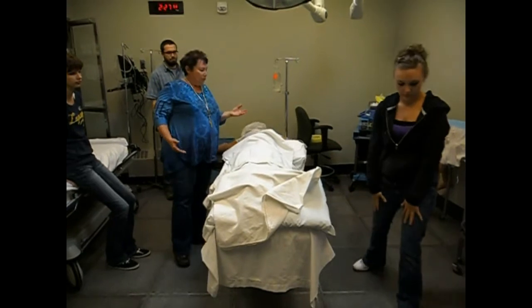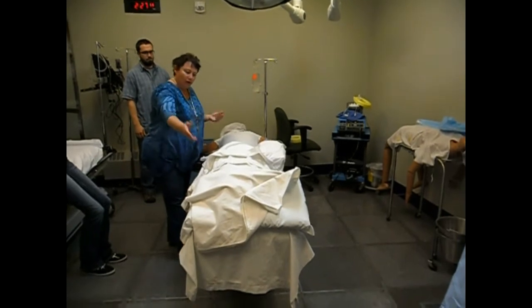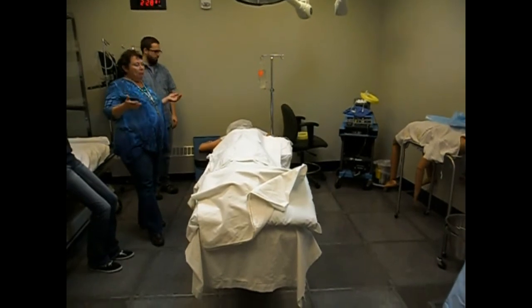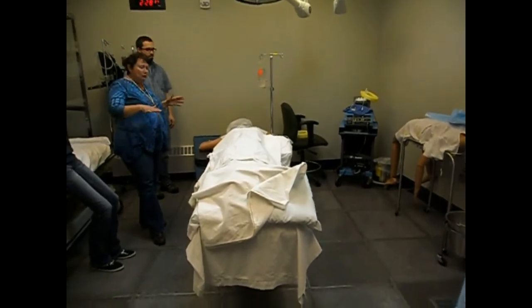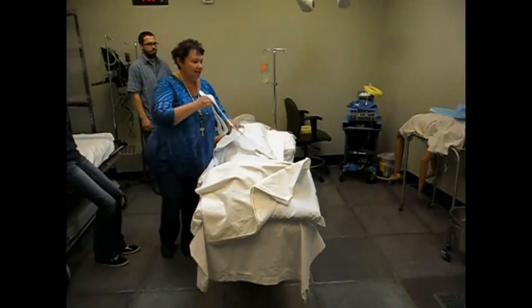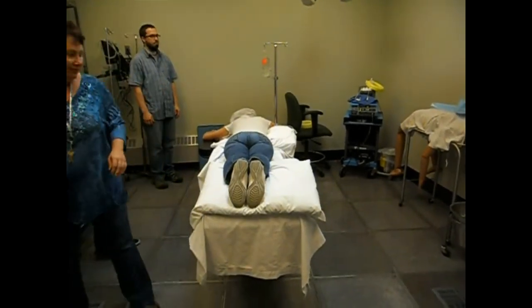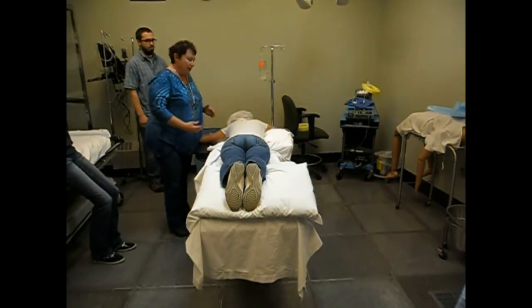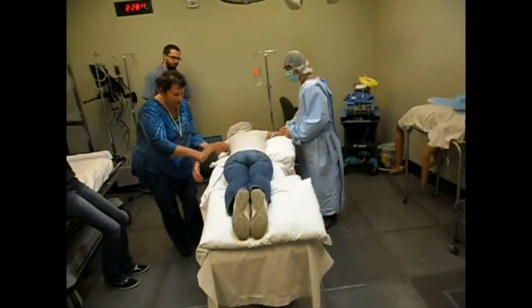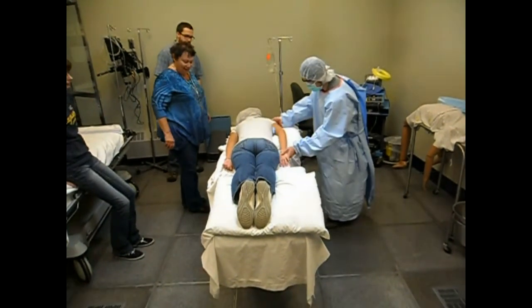tight. And then if we were doing back surgery, when we get our prep ready, we could lower this and then prep her back or her ankle for Achilles tendon surgery or whatever. Now, to get her back from prone to supine, it's kind of just in the reverse order. The first thing we need to do is to take the safety strap off. We need to take the blanket off. We need to get both arms back. So we would take her elbow and her shoulder and make sure we don't hyperextend anything and put her hand back at her side without breaking anything.